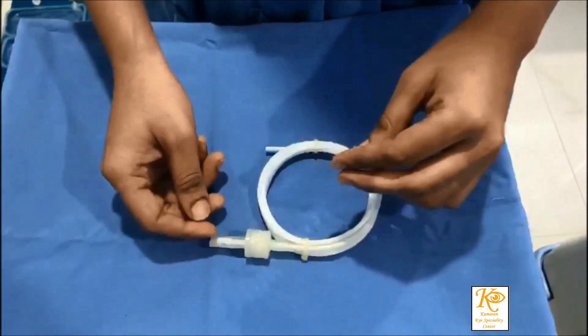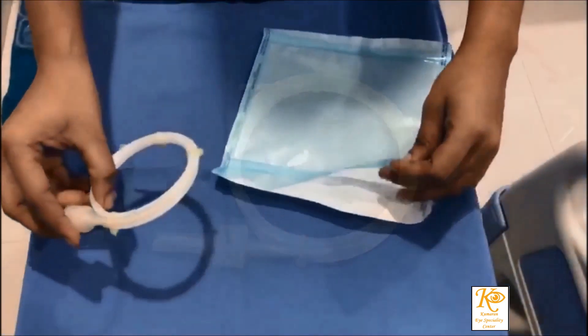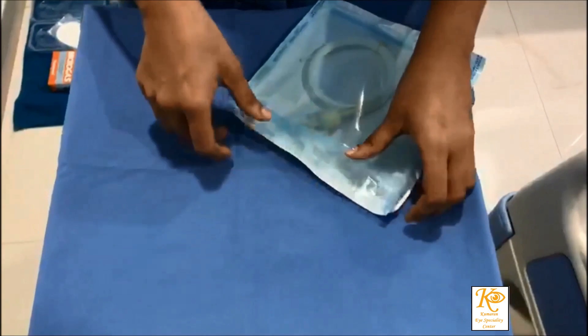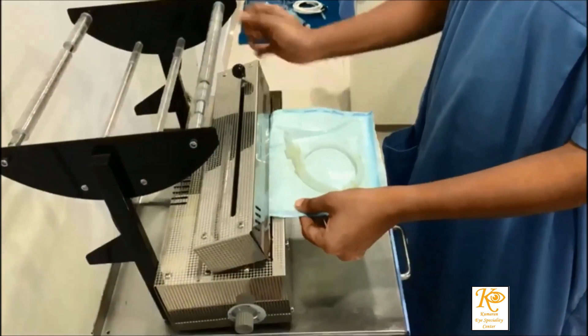The Helix test strips are folded in such a way that the chemical indicator comes on the inside and the folded end goes first into the casing. The casing is then closed into the tube tightly.